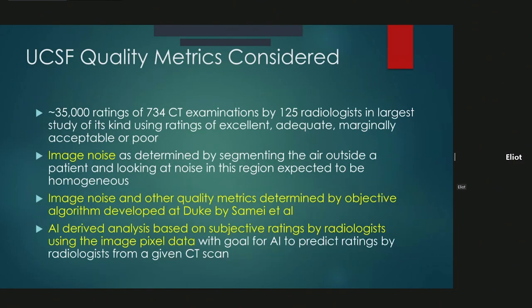And so in the study that Dr. Smith-Bindman did, there were tens of thousands of ratings of, I think it was 734 CT examinations by 125 radiologists in the largest study of its kind, using ratings of excellent, adequate, marginally acceptable, or poor. And so we essentially had multiple ways to look at noise, determined by segmenting the air outside the patient, noise within the image as judged by a variety of physics parameters developed by Dr. Samei and his colleagues at Duke. And then we also used a technique similar to what Mary Ellen Geiger used, where we actually had the AI systems assess the pixel-based information.